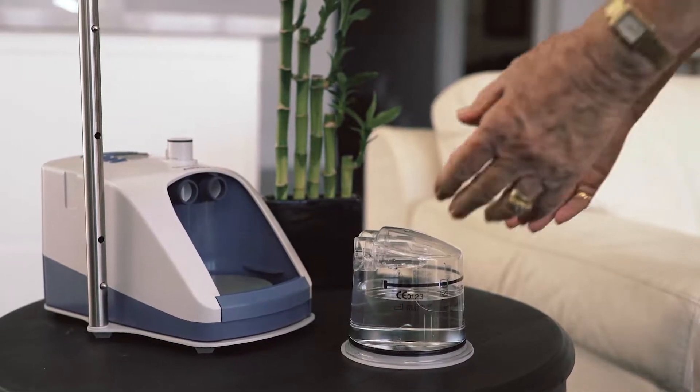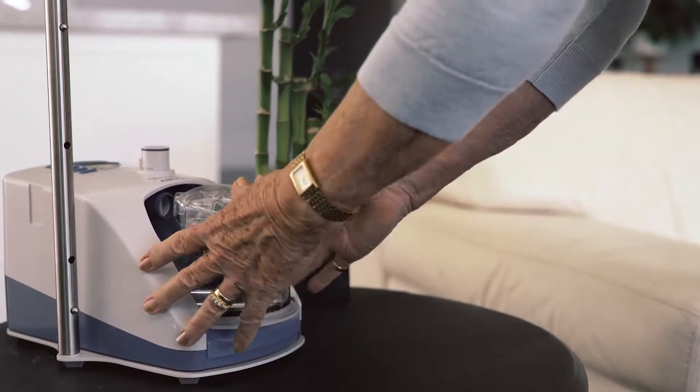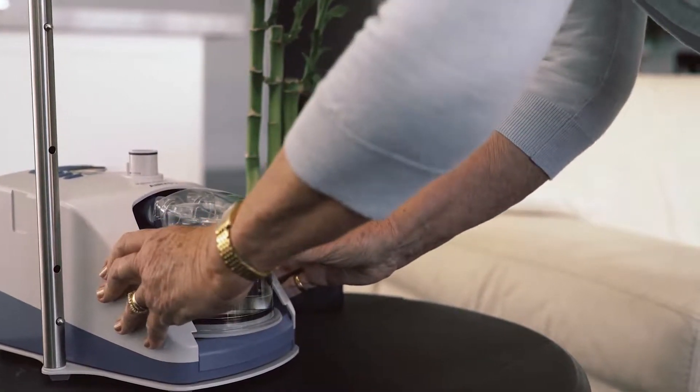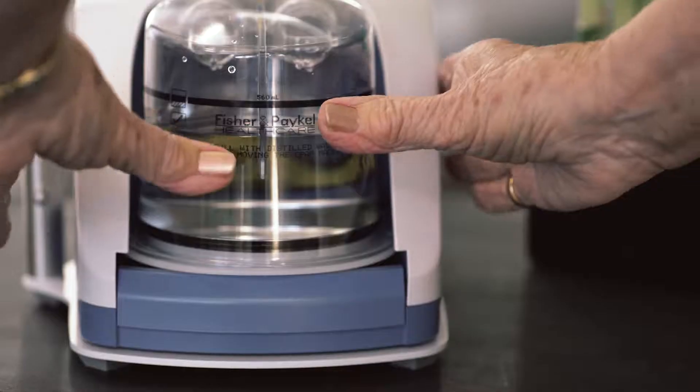Fit the water chamber to the unit by pressing down the finger guard and sliding the chamber on, carefully aligning with the blue chamber port ends. Push the chamber on firmly until the finger guard clicks into place.